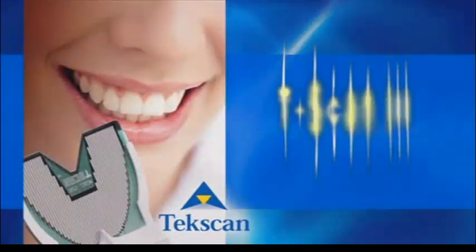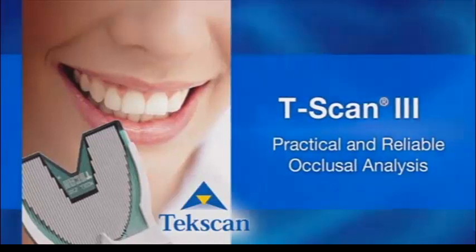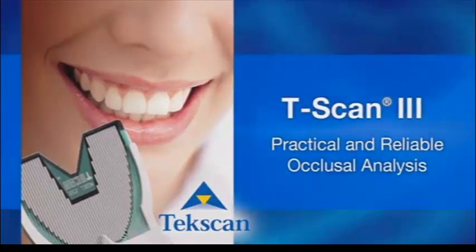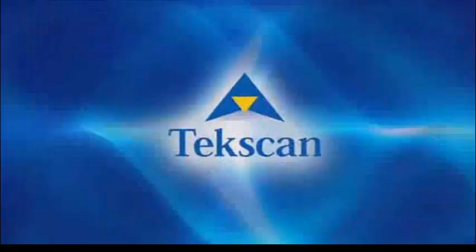Computerized occlusal analysis gives you the control to refine occlusion. In this presentation, you will see an occlusal adjustment on a live patient with the T-Scan 3 system.